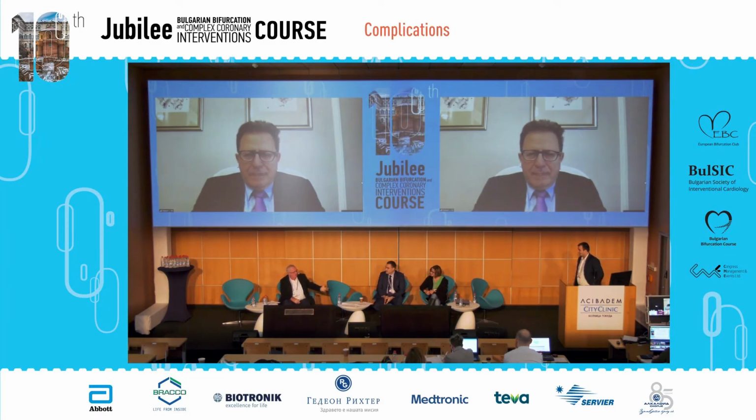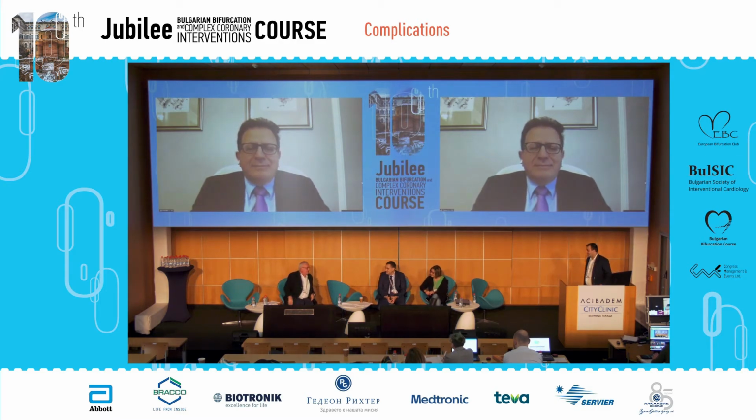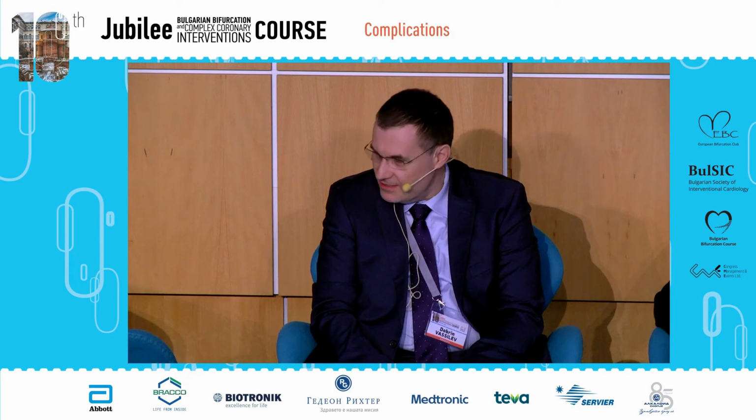That's why I prefer left main, you know, instead of going distal in a small calcified vessel. So, yeah. I remember some nightmare like this. We all had. Because Nikki showed me this case, and I asked him to present it here today.